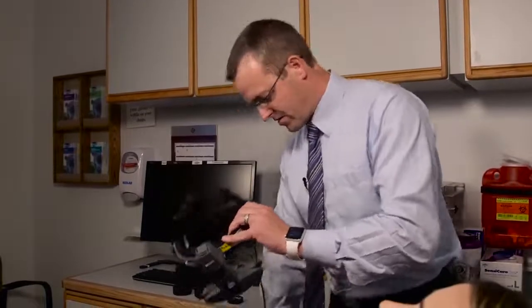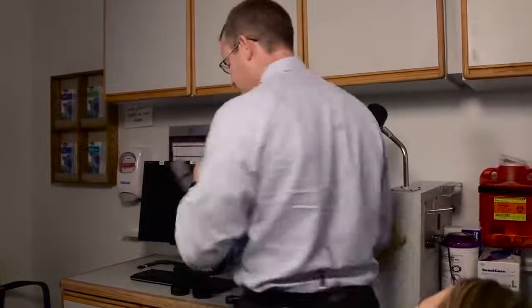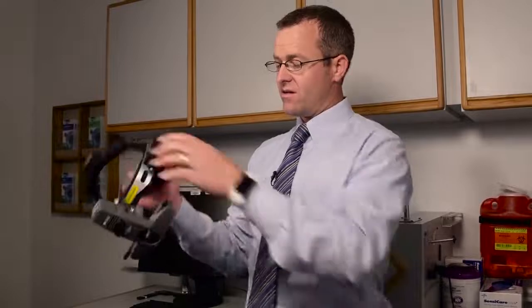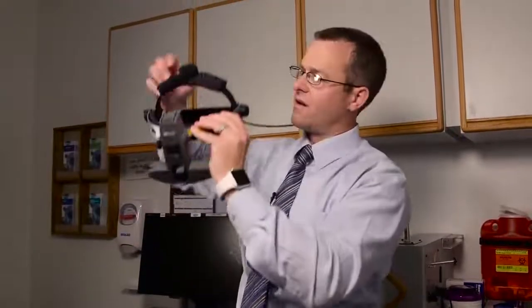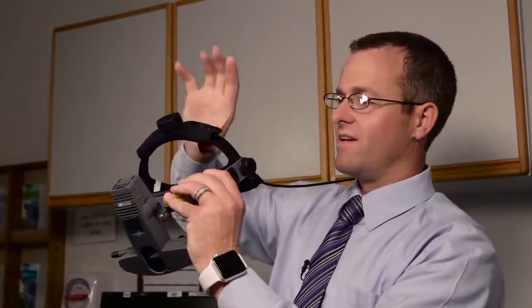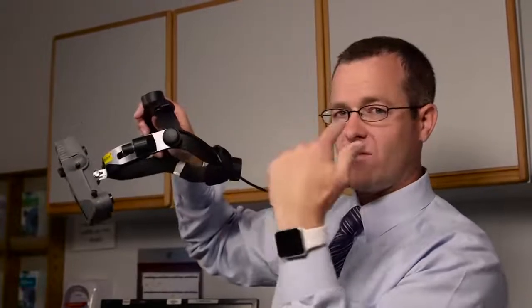So I am going to go ahead and spin. So the cord's on my other side. And then in doing this, you're going to put it on. The upper knob will shorten the height of this sitting on your head, and you want to make sure the eyepieces are level with your eye. The back knob will tighten it.